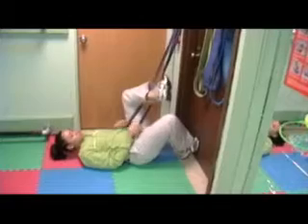This is a good exercise — it assists the patient or person who has low back pain. She's wiggling around to loosen up and get some mobility in the lumbar vertebrae. It's a simple exercise but very effective.